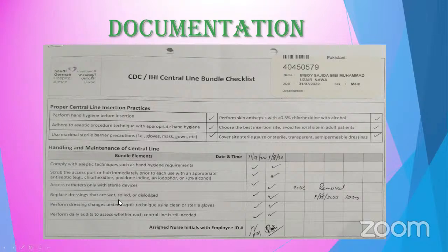Replace the dressing if there is soiling. We will also check if there is leaking or dislodgement. Then perform dressing changes under aseptic technique using clean sterile gloves, and perform a daily audit to assess whether each central line is still needed. As we can see, the UAC should be no longer than 5 days, and the UVC should be 7 to 10 days only.